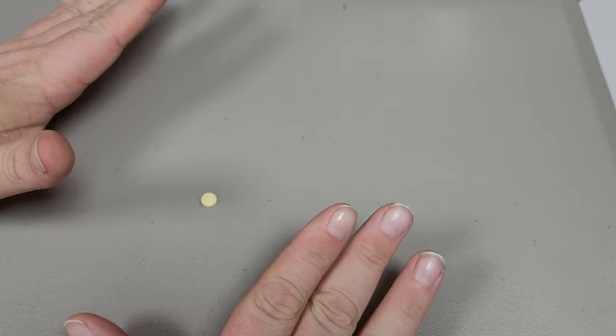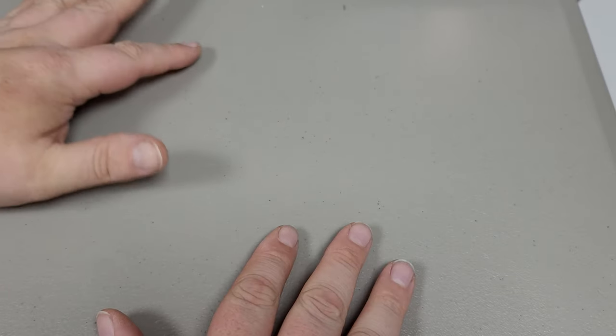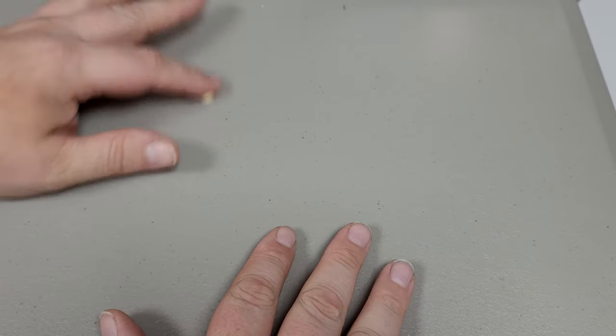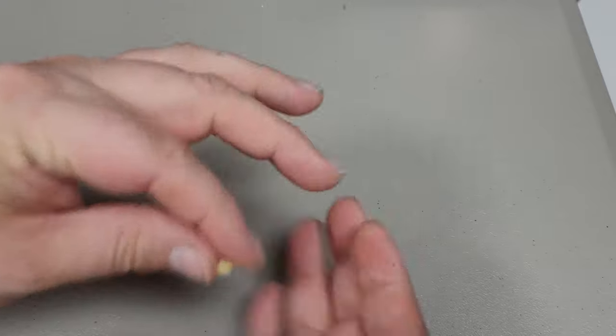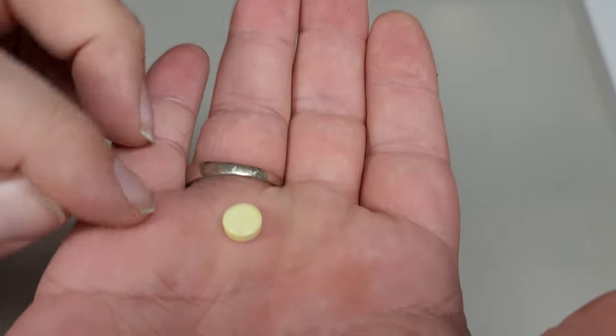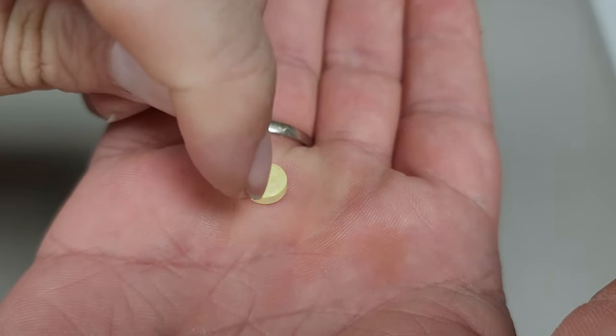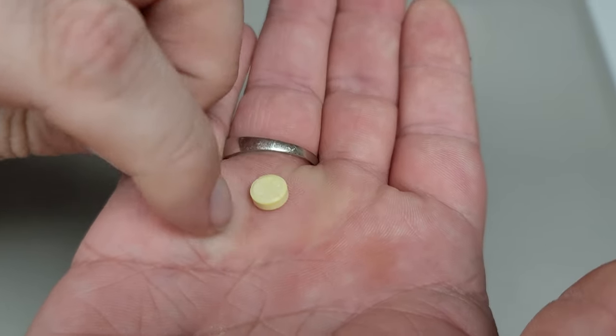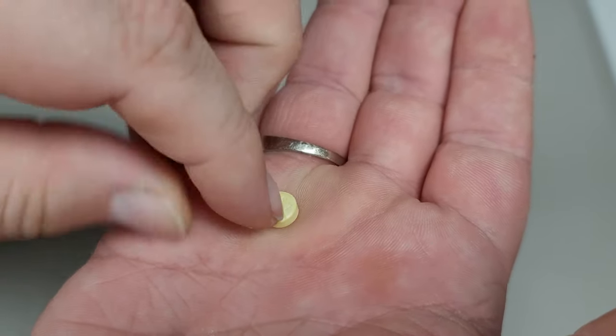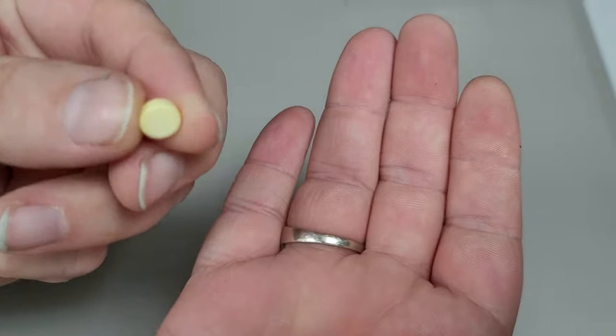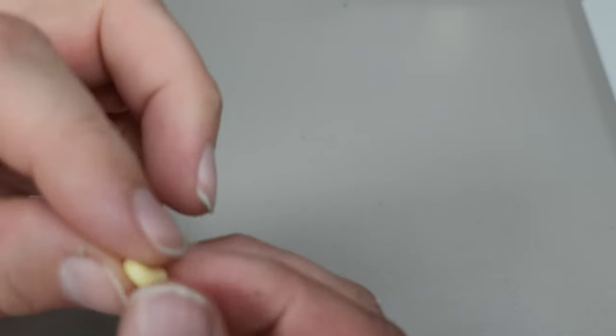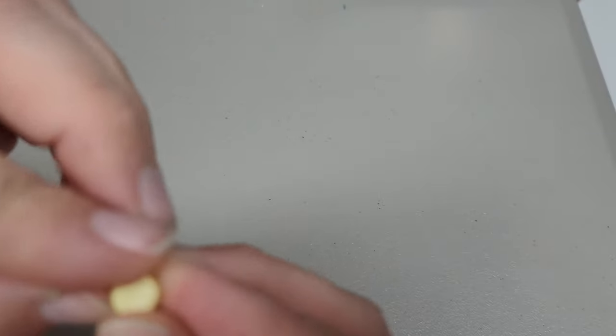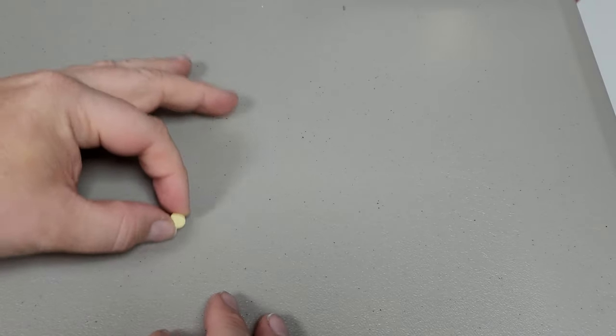So why not just use a regular commercial pill splitter? They have blades in them, right? Well, when I use a commercial pill splitter, the blade starts going in and then it goes off to one side or the other, and then it creates a crater of powder in the middle. So that's not exactly useful. These things are best broken in half by snapping them, not cutting them.